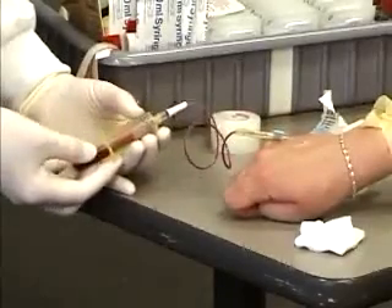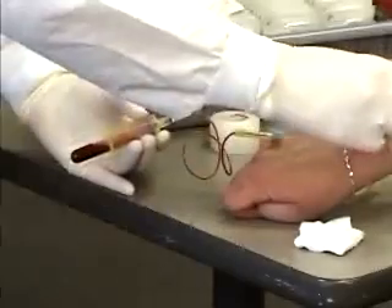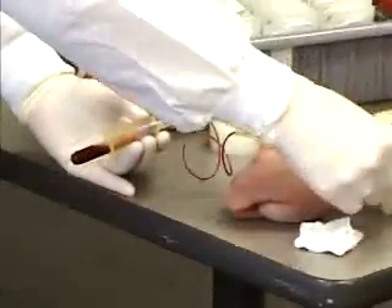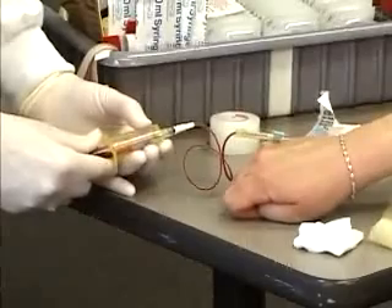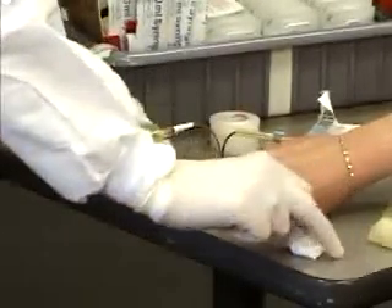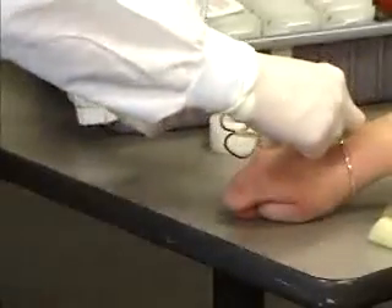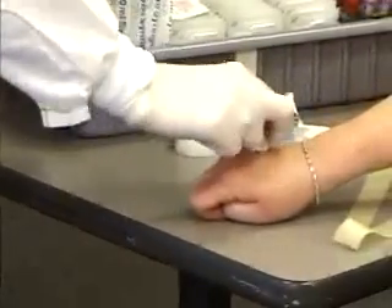Release the tourniquet and remove the tube. If you leave the tube on when you take the needle out, the remaining vacuum can cause the patient to bruise. Then withdraw the needle swiftly and apply pressure.